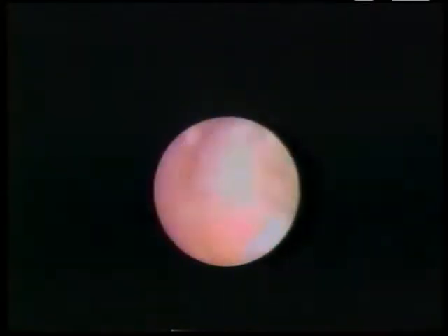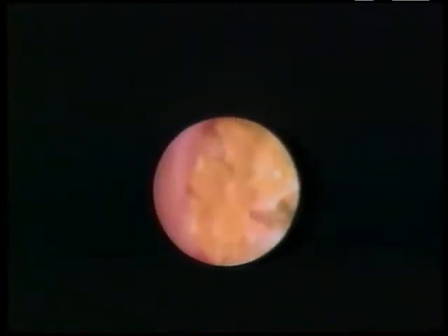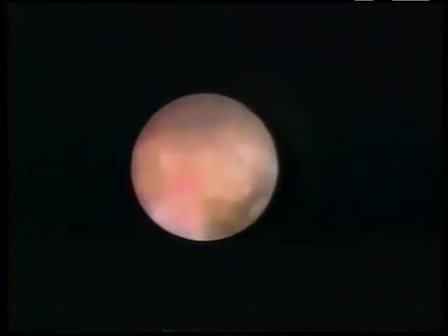The vast majority of the calculus was broken into tiny pieces which were irrigated from the ureter. Other fragments were retrieved with a basket or a wire-prong grasper for assay. When the ureter was clear of all fragments larger than 1 millimeter, a guide wire was left in place to allow passage of a flexible ureteroscope to the intrarenal collecting system.